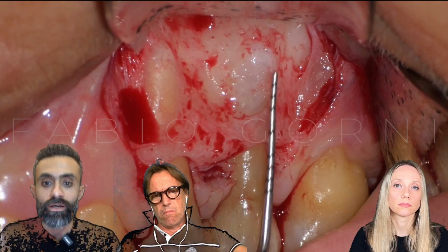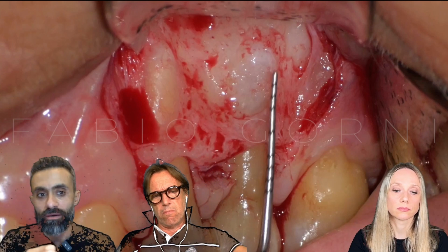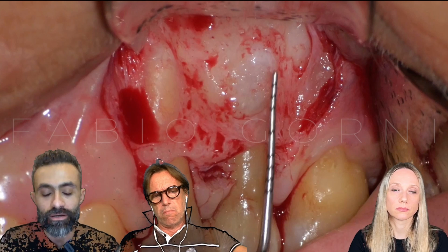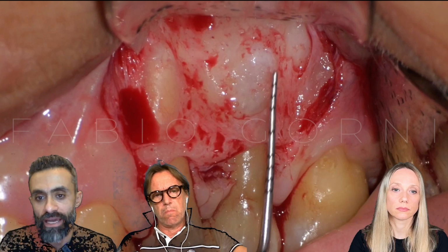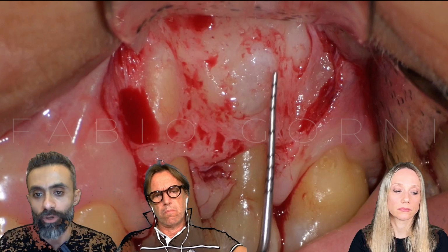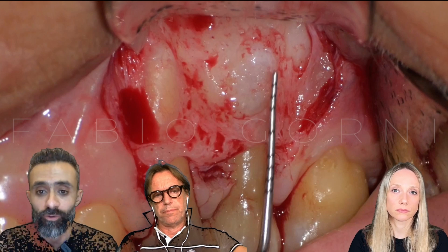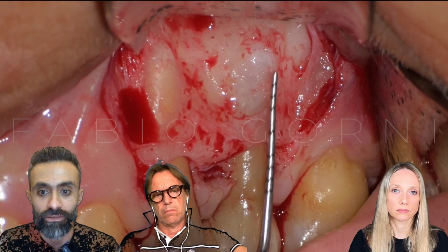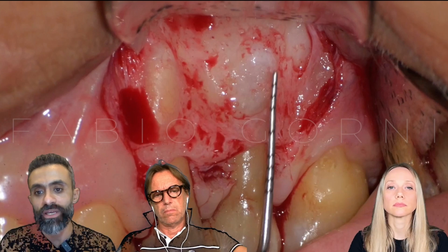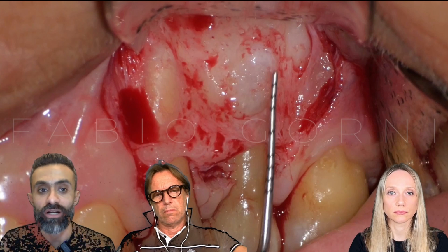That's great. Apart from this case, because this is a maxillary tooth, when we reflect the flap in the mandibular premolar area, there is a specific area that creates a lot of panic to us, which is the mental foramen and the neurovascular bundle. So, what measures can you advise to protect it during flap elevation and retraction, the mental foramen?